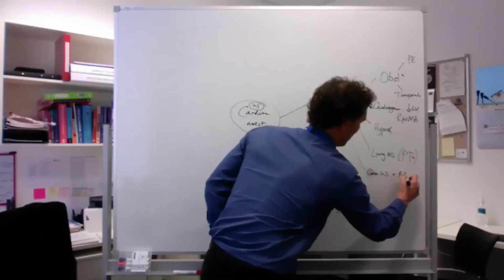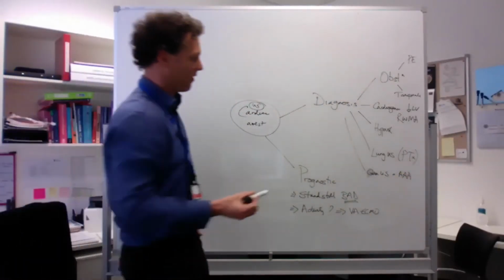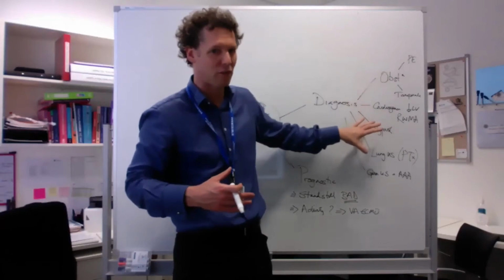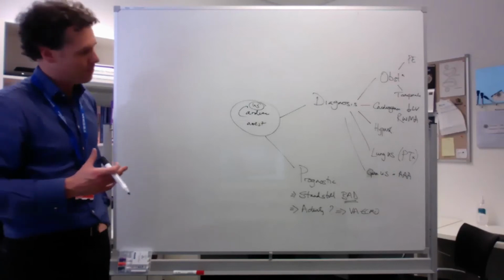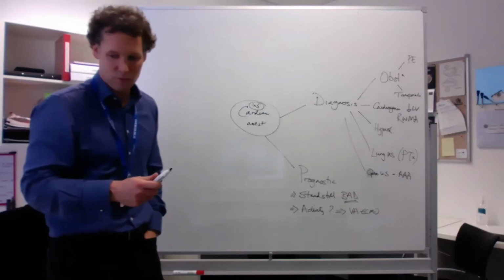Thinking about the AAA is another obvious one that jumps out. And discuss the use, just mention it a little bit. You don't have to go into super amounts of detail unless it's asked in the question. So, keep going. Is there anything else? What else do you want to say?